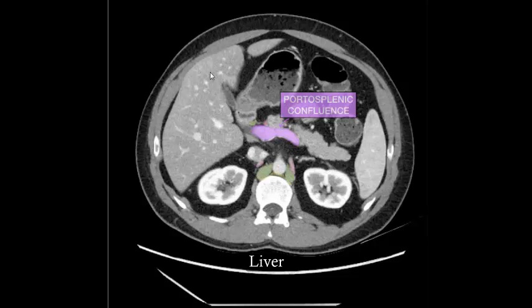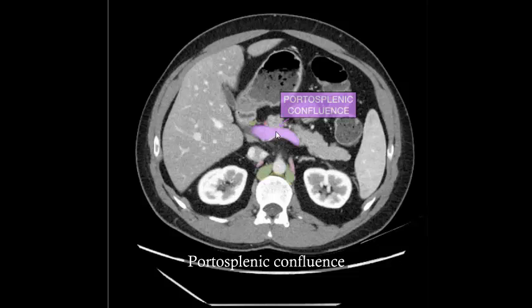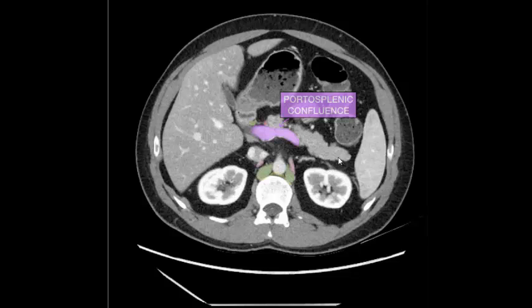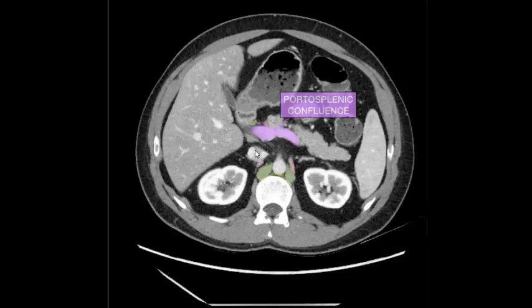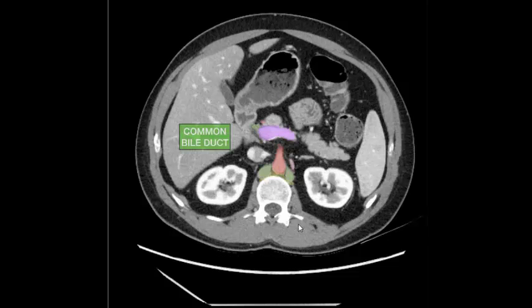Liver, gallbladder, abdominal aorta, head of pancreas, head of pancreas, body of pancreas, tail of pancreas, splenic vein, transverse colon, gastric antrum of the stomach, neck, right and left celiac ganglia, inferior vena cava, abdominal aorta, common bile duct.